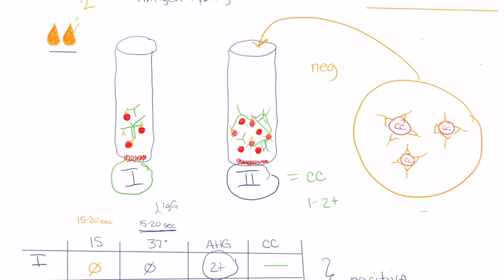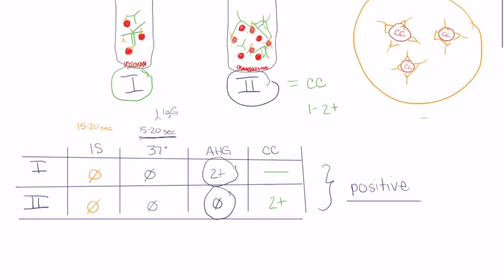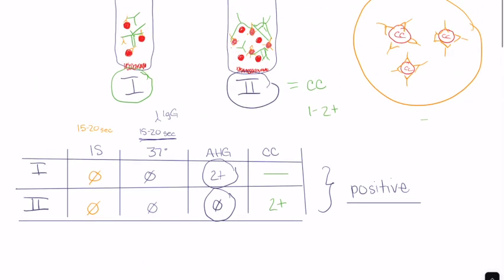So that's a positive antibody screen. Okay, so we have now determined that we have a positive antibody screen. So what's our next step? Or what exactly does this mean? So our positive antibody screen is just a screening test. If you remember, we talked about like HIV screening tests and so forth, a strep screen test previously.